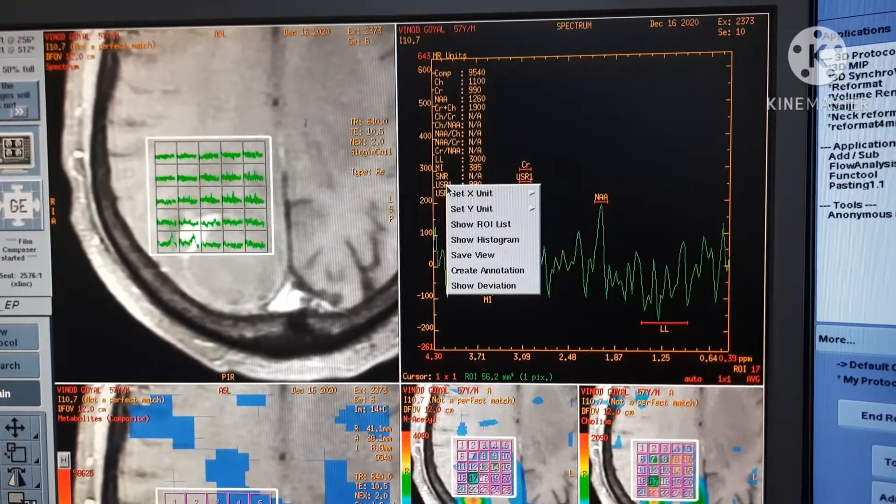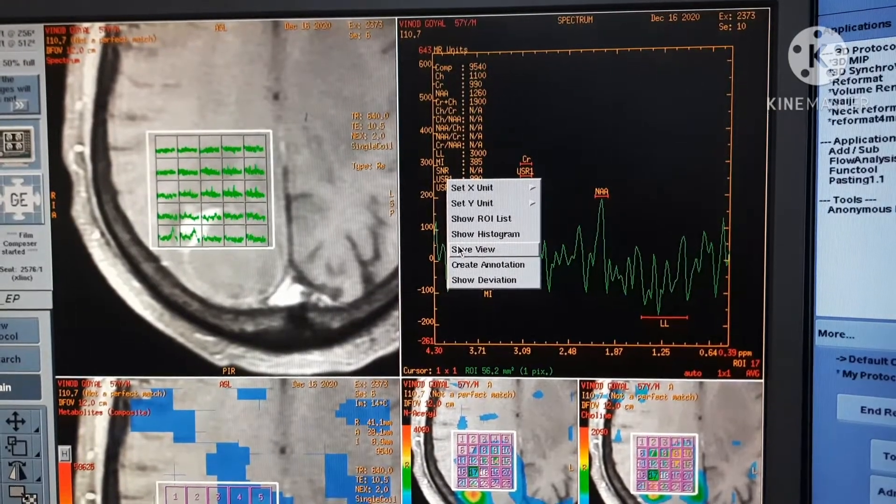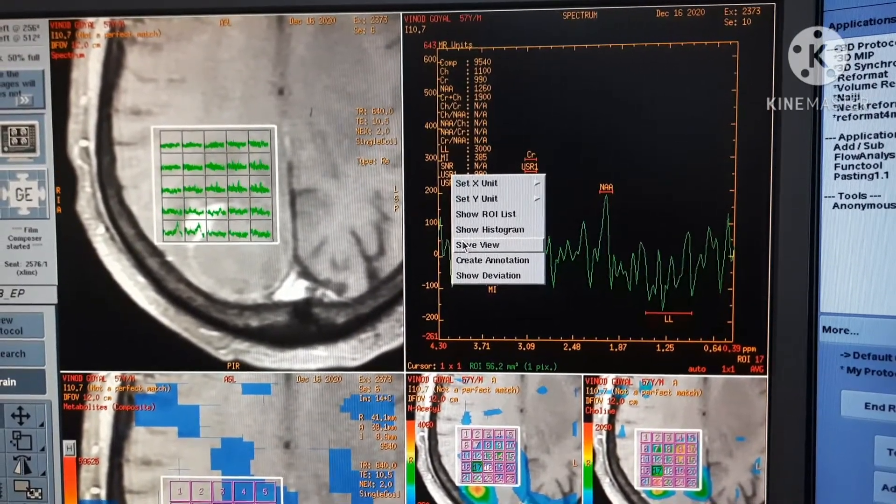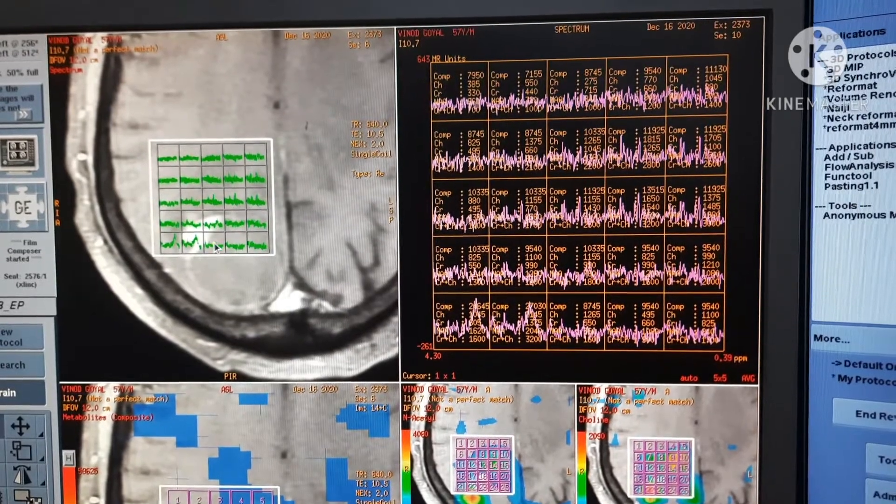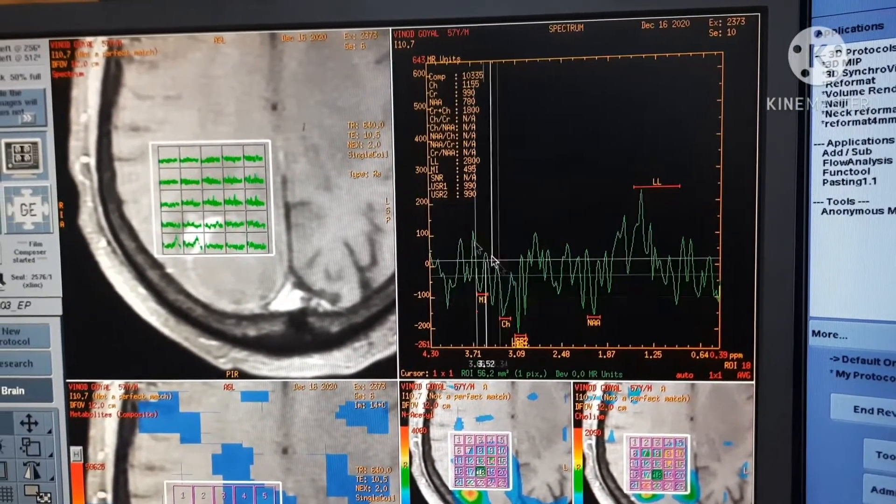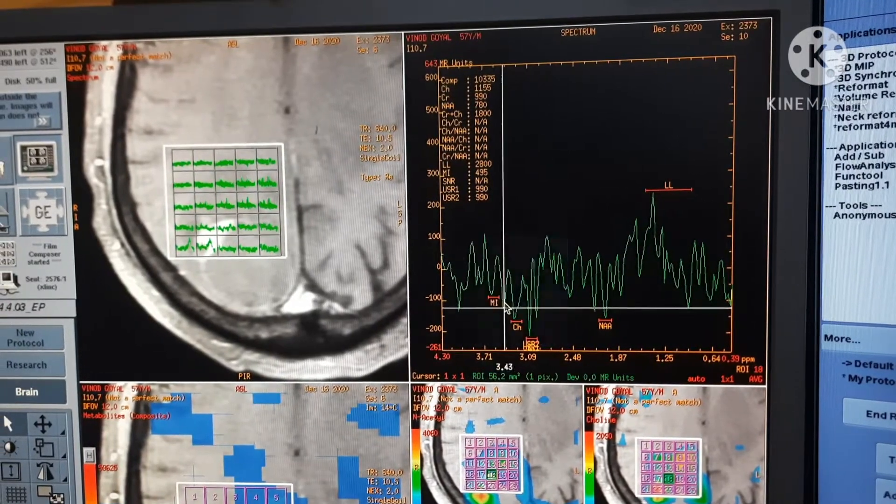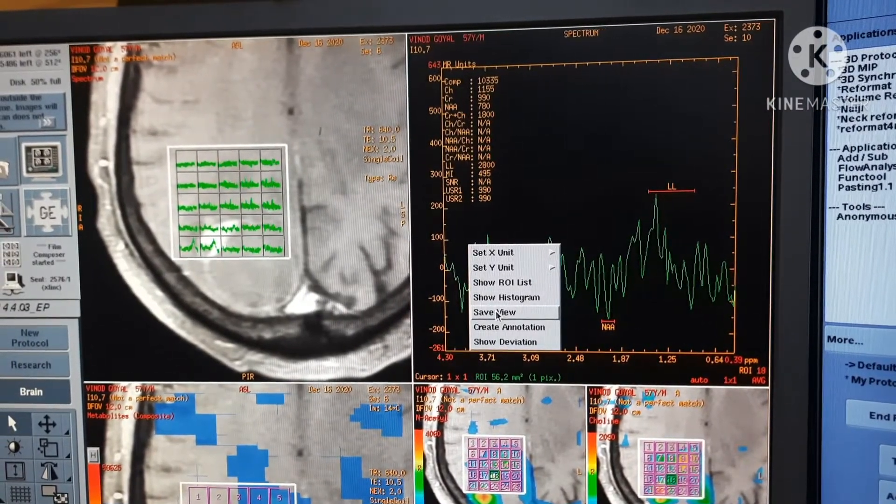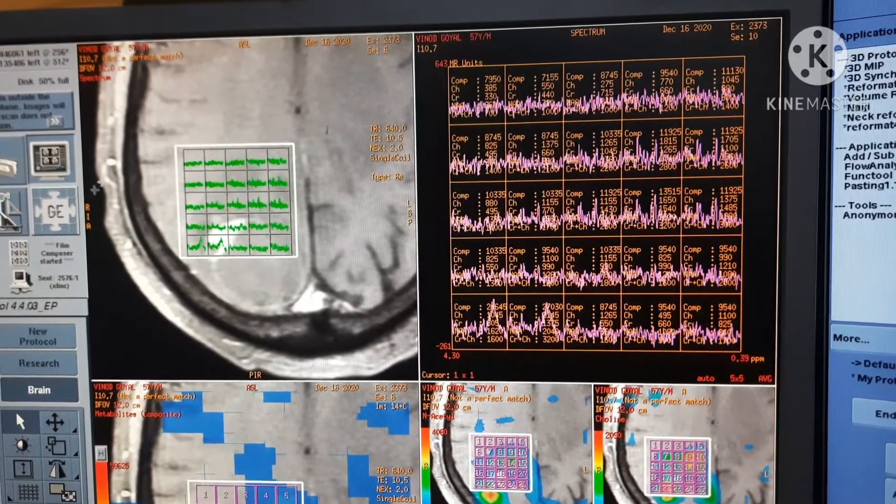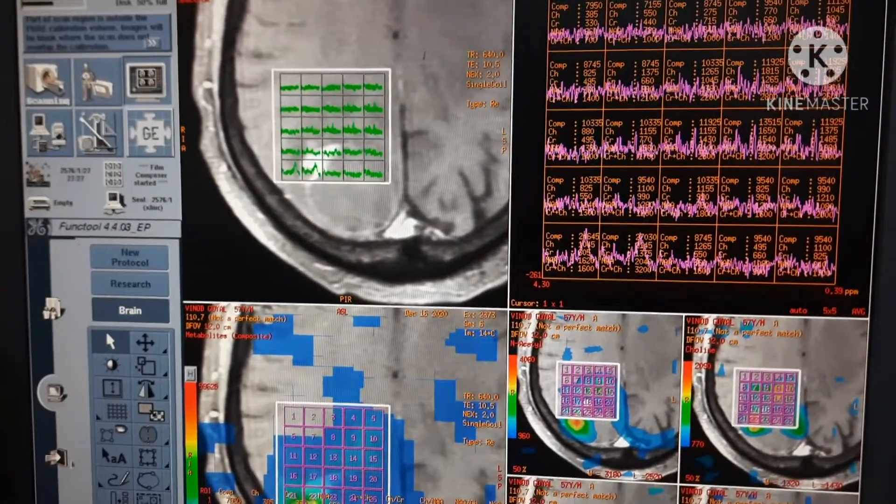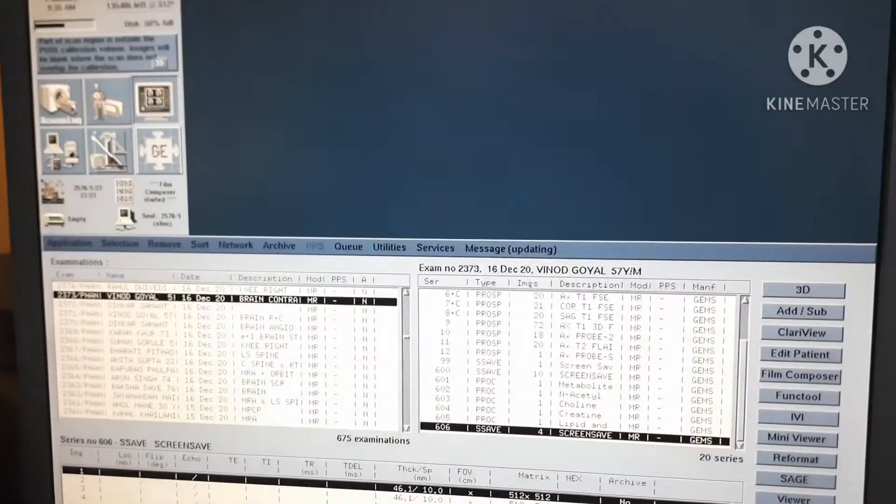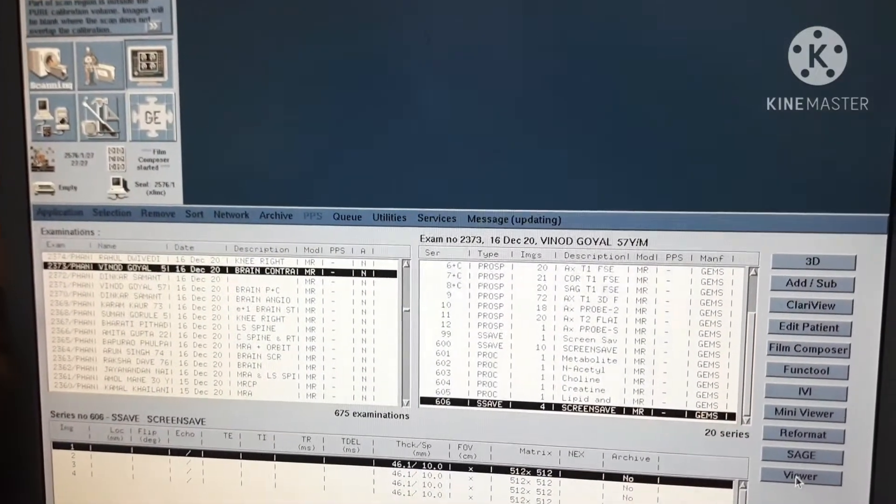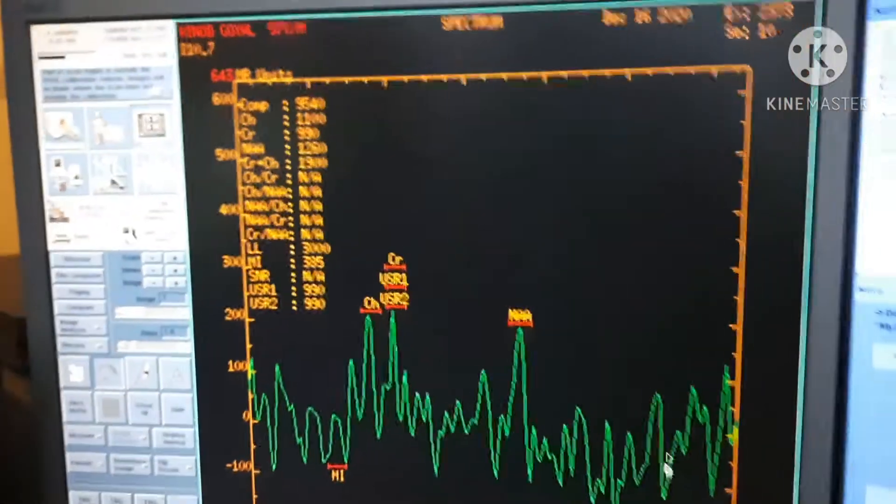Now, we have to save the particular graph. You have to select the right key and you can save the particular graph. It will be saved on your database, patient database. You can see it on your patient database.